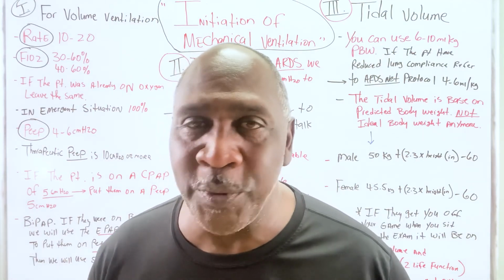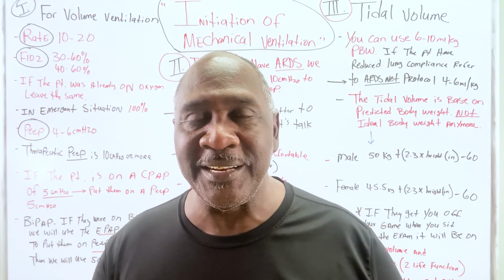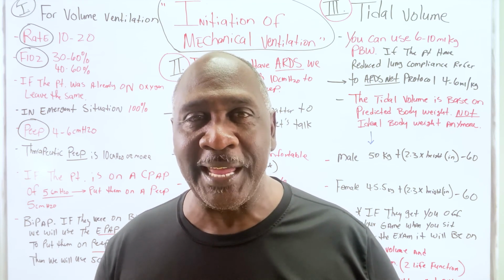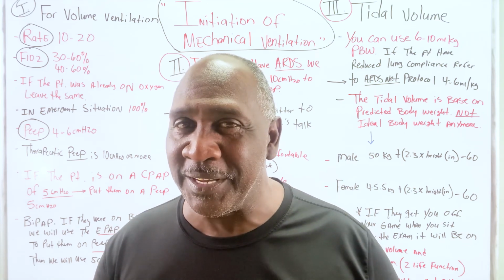Hey guys, that one was fun. Listen, you have to know the initial settings of the ventilator on this exam. Don't let them get you on the tidal volume and the FiO2. That's where they try to get you, okay?